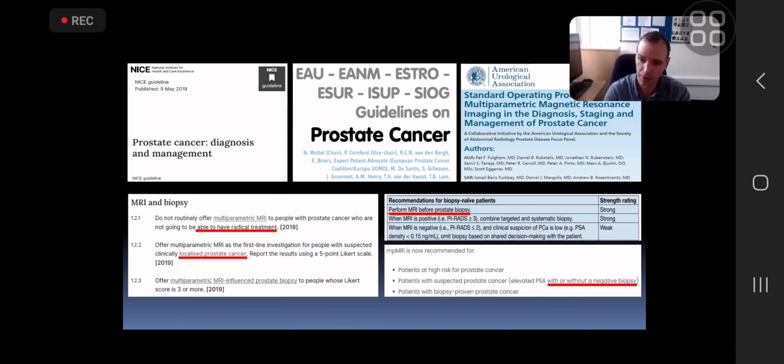The first step will be MRI, and in low probability cases, avoid any subsequent biopsy, and in the higher probability cases, direct the needle to the abnormal areas on the MRI. So that's quite a big change in practice that's happened in recent times, and questions can arise around that concept, either in the written exams for the FRCR or in the practical 2B vivas.